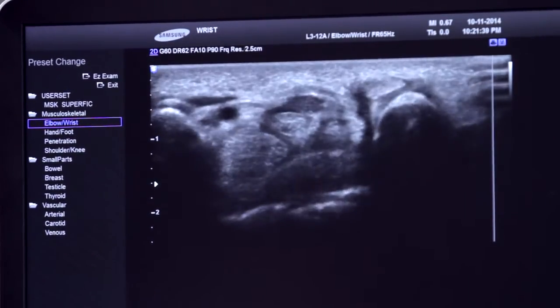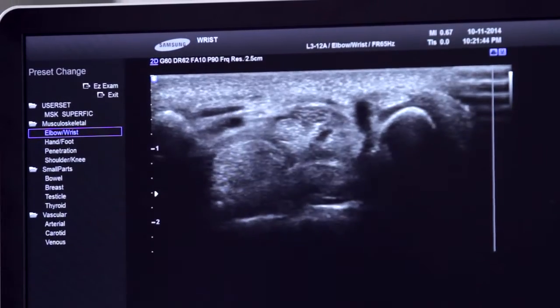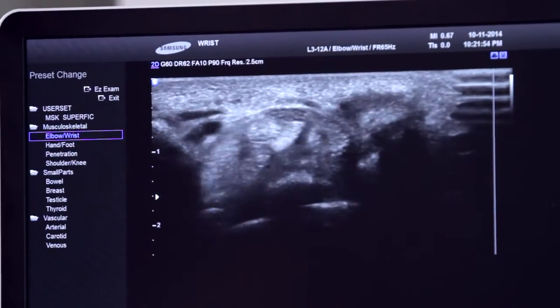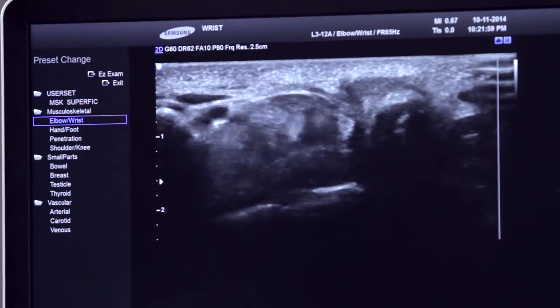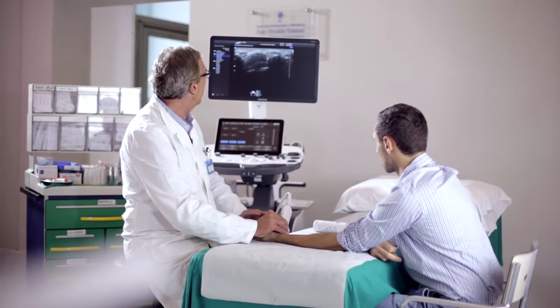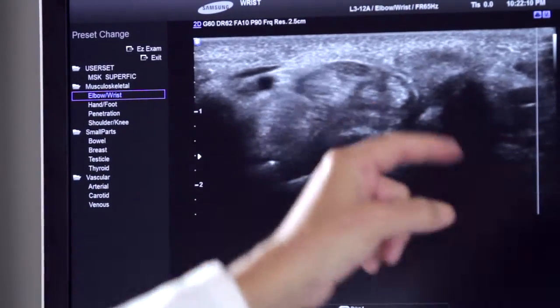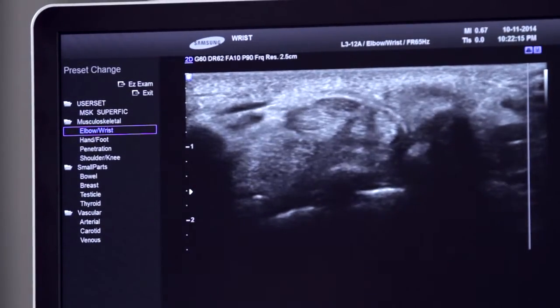Having said that, we recognize within the carpal canal, below the median nerve, the superficial and deep flexors of the fingers. If you invite the subject to move and flex his fingers, we see that these tendons move. As you can see, we have the opportunity to see the flexors of the fingers moving. The curious and important thing is that this flexion and extension of the fingers does not make the median nerve move along with the flexors, but it moves sideways from the left to the right and vice versa. And this happens in normal conditions.